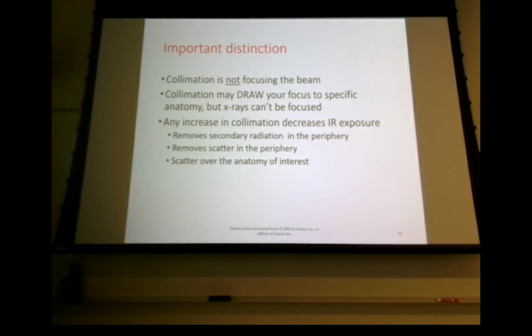The stream of X-rays does not focus, you just block it and prevent some of it from striking the image receptor. See the difference between the two? The X-ray beam is not focused, but you can focus your attention, by increasing your collimation, on the things you're most interested in seeing. Got it? Okay.